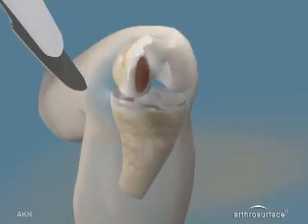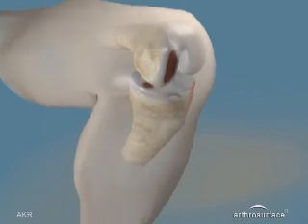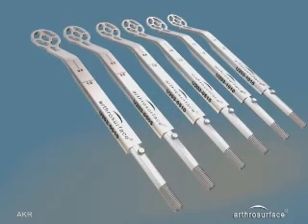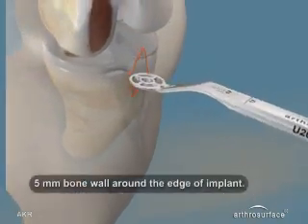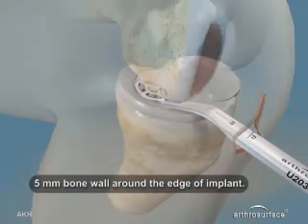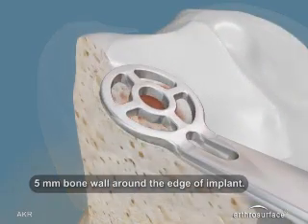In this technique, we will prepare the tibial side first by making a portal a little larger than a standard ACL portal. Select a template and place it over the defect. You must leave a 5 mm bone wall between the anterior tibia and the template, and also the medial wall and the medial side of the template.